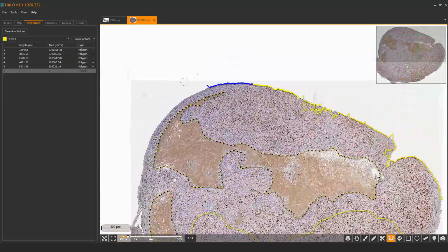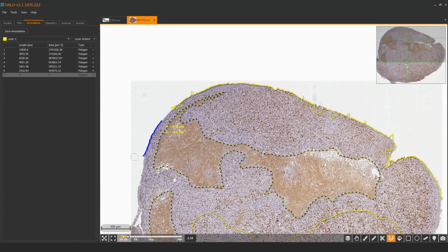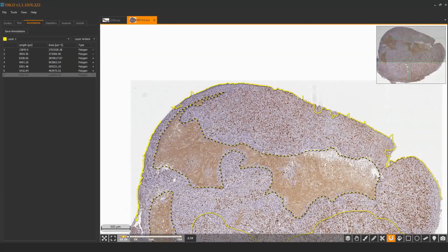So it's tracking, like so, tracking, tracking. And then if I press Enter, it'll save the last yellow piece of the line in this instance. Obviously, the other annotations could be different colours, but you'll see the bit that's in process. By clicking, you save it and move along. So that's the magnetic pen tool.